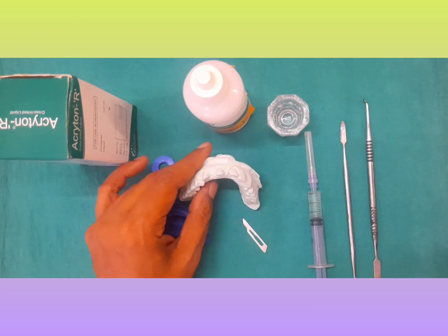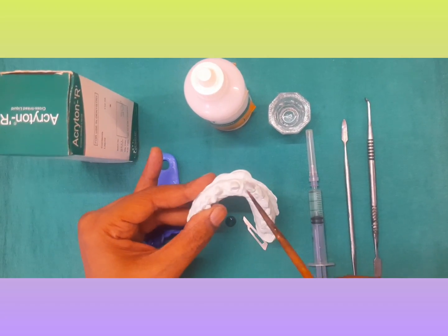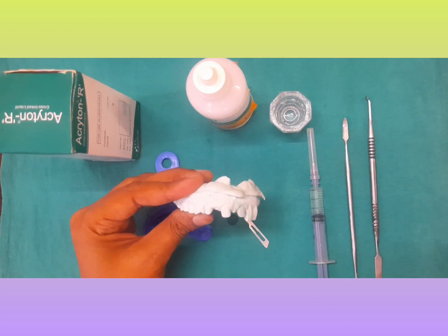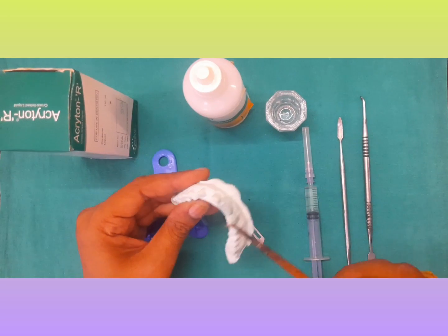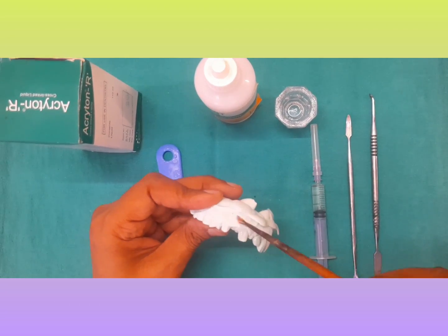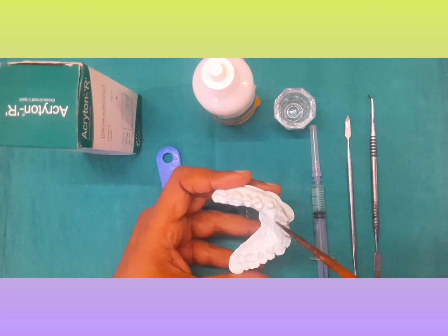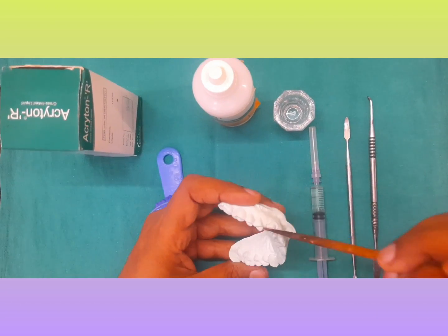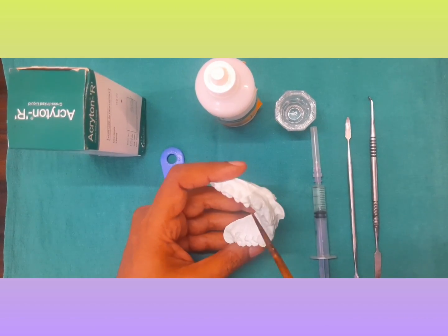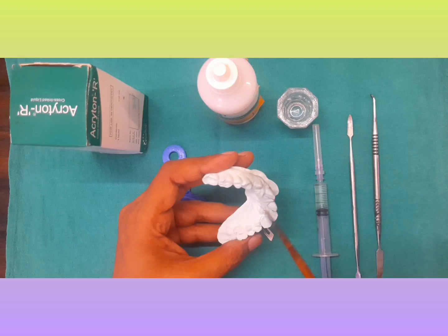First of all, you apply cold mould seal on the prepared teeth like this, and you should apply it nicely on the surrounding teeth also. When you are removing the temporaries, you realize that cold mould seal should be applied in these places as well, because it becomes very difficult to remove the temporaries from the cast. So apply at least two layers of cold mould seal so that it is very easy for you to remove.